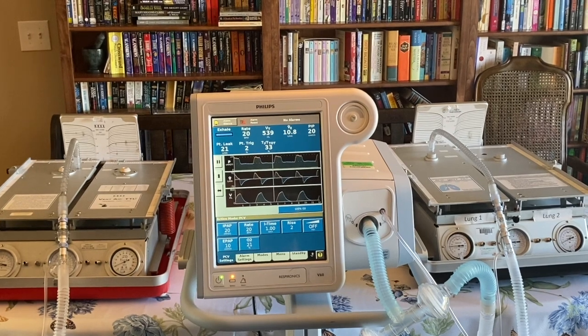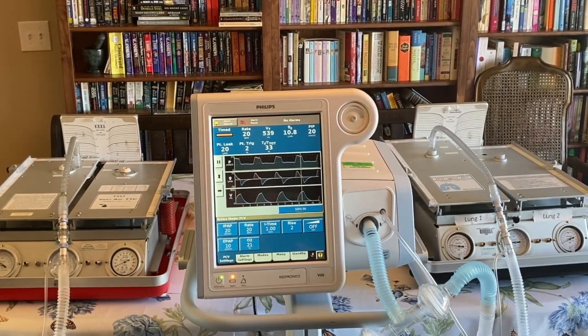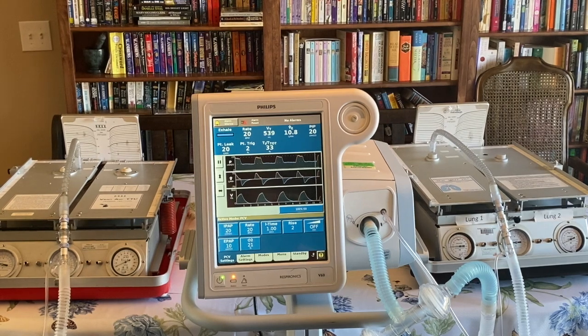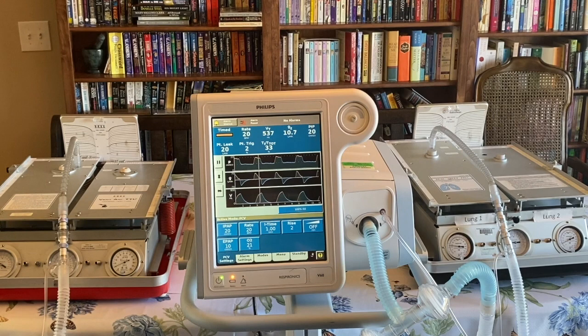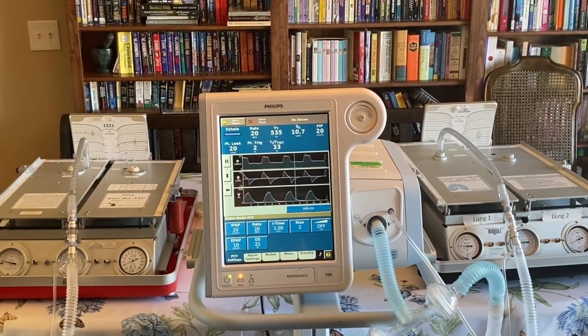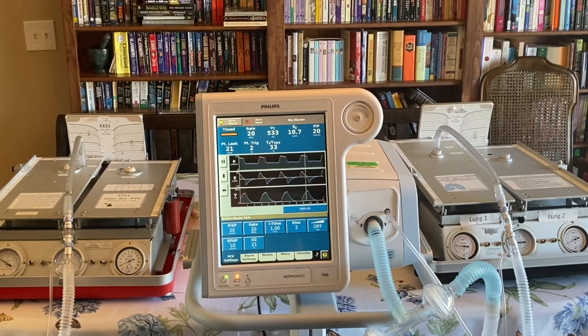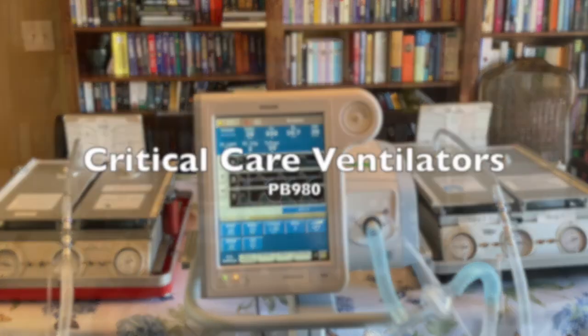As a disclaimer again, this is on test lungs. I have never done it on animals, and I've never used this on human subjects or patients. However, I'm confident that this will work. As you work with this, if you see problems, if you try it and it works, please email me and let me know. Now we've connected two circuits to the PB980.